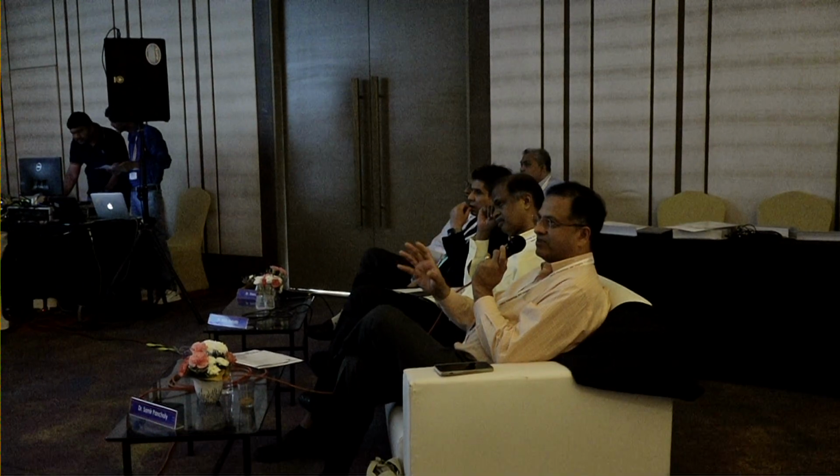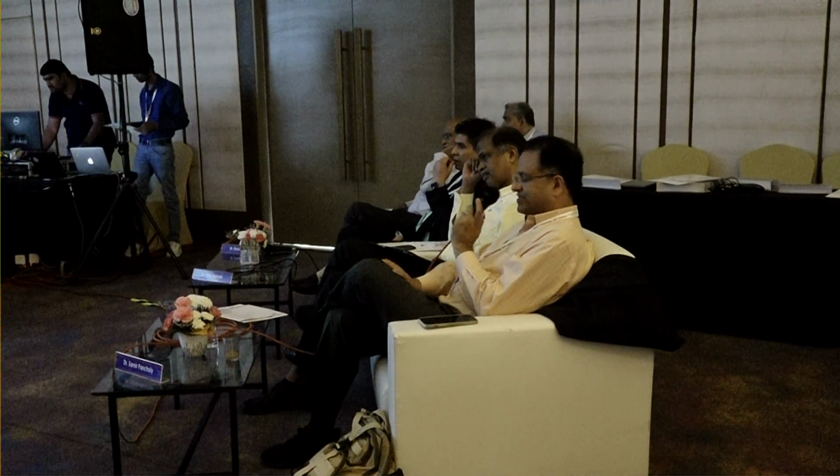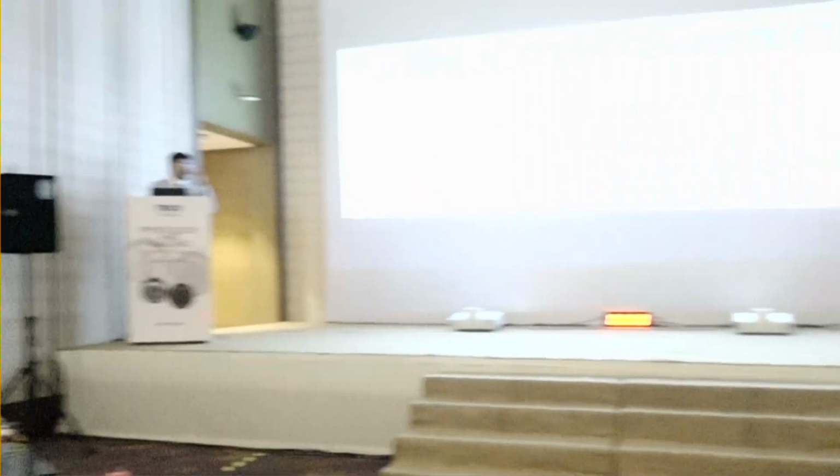Does that give the saline dimensions somewhat of an advantage, because you're giving nitro and contrast, which are both ways of dilating? Yeah. So that is what I was sharing, that in one letter to the editor by Ziad Ali in JAG, he published data showing that with saline he was getting smaller diameters, but they never published how they did it. So we thought that this sequence of NTG contrast, NTG saline must have made a difference, because even now we are doing another study on saline OCT with a large sample. We are observing that many times we are getting higher measurements as compared to contrast, number one. Number two, even if the difference is there, it is not significant as far as PCI optimization is concerned. So before saline OCT, it's always advisable to give at least 100 microgram of NTG.